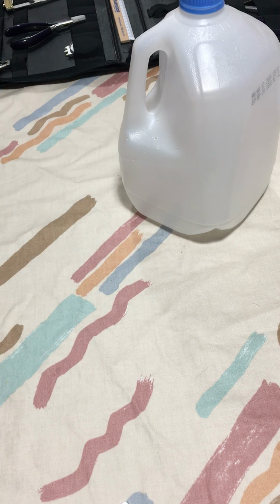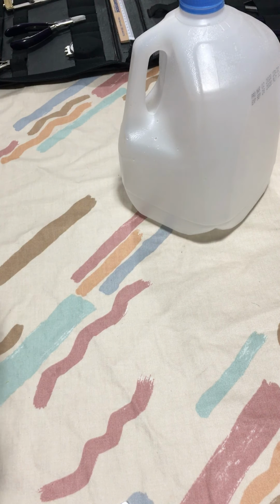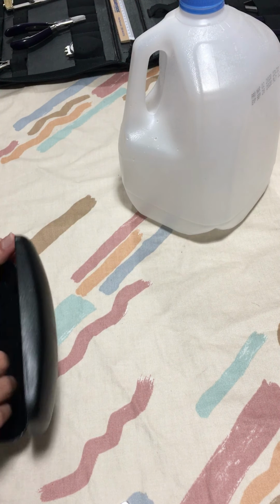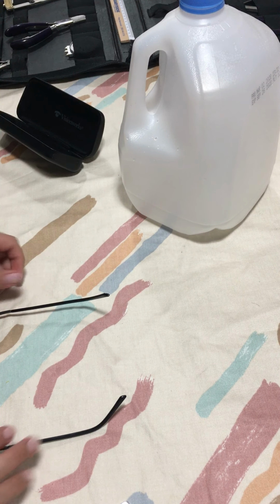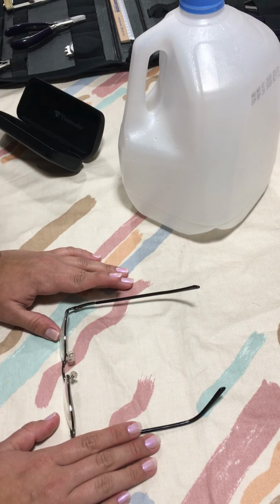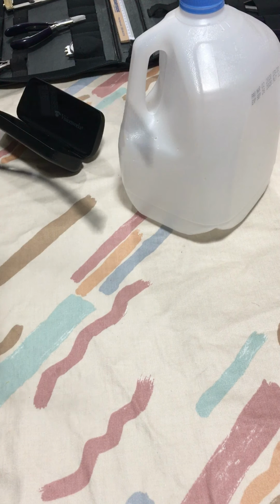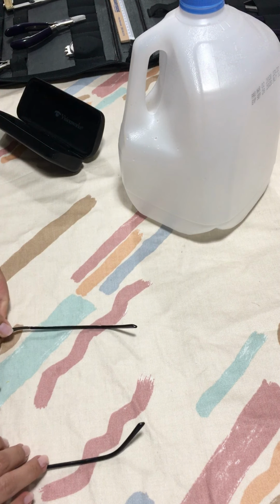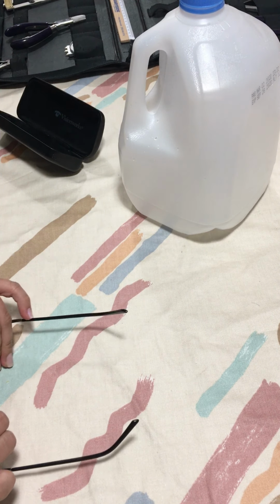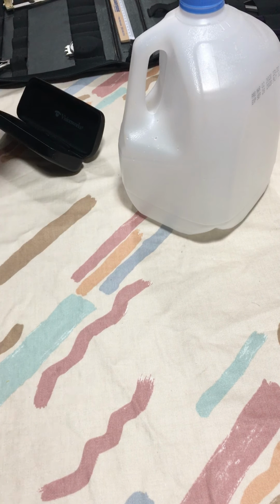Okay, the last misalignment that we're gonna be working on is going to be the temple fold. So the temple, we have fixed everything on the glasses. We need to double check that everything is good. On this frame, I could see that it has a little bit of temple parallelism, as you could see. So what I'm gonna do is I'm gonna fix that. Okay, because the temple fold is the last adjustment. That is when we have checked everything, nothing has changed, everything is good, all adjustments have been done well.